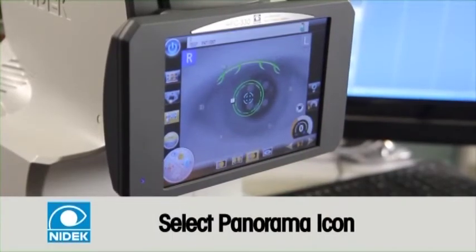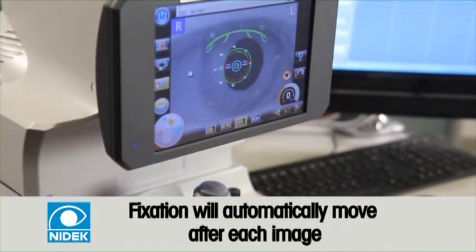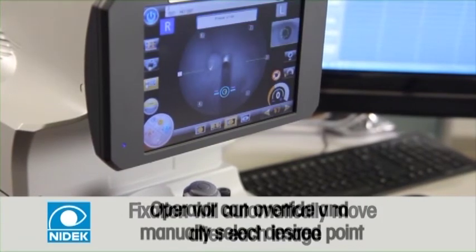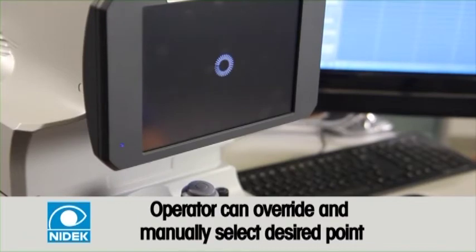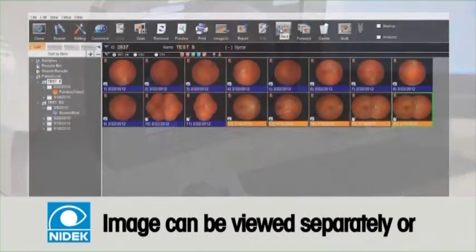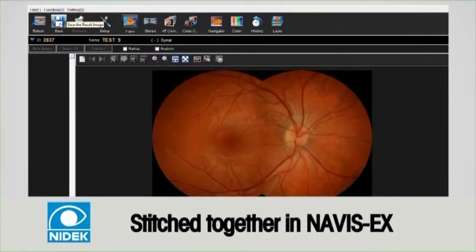When the panorama setting is selected, the camera will automatically move the internal fixation to the next point after the image is captured. It is not mandatory to capture all preset points. The operator can override the camera and touch the desired point to capture next. The captured images can be viewed separately or automatically stitched together, creating a montage using the NIDEK software program.